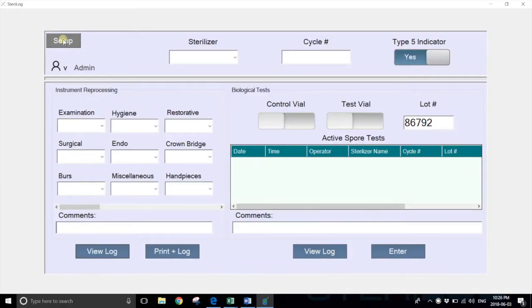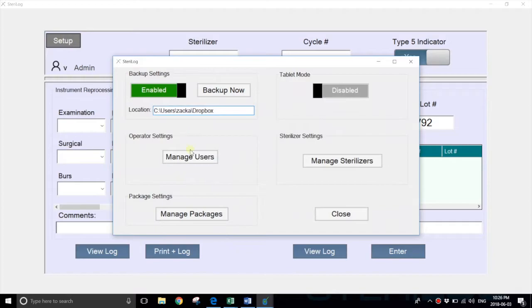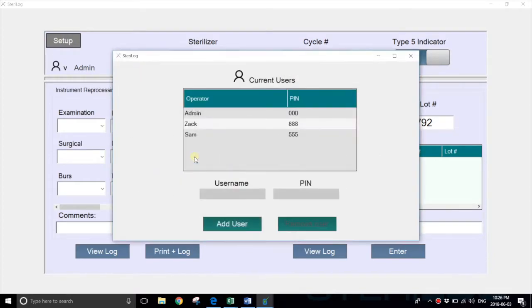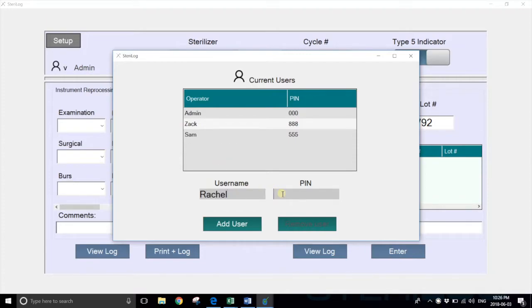You can then launch the setup and select manage users. Here you can key in your users. For example, if we wanted to add Rachel with PIN 111, you just key that in and hit add user.